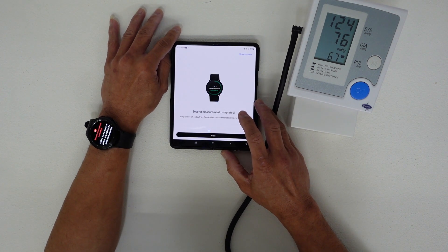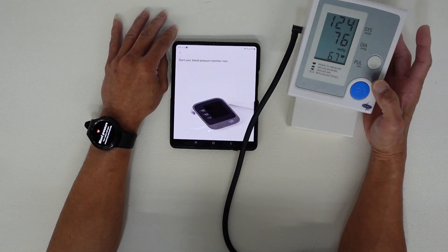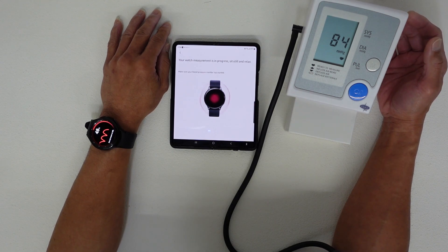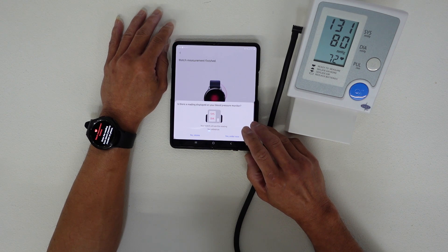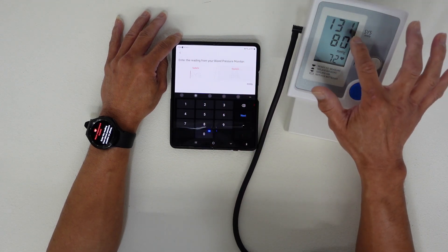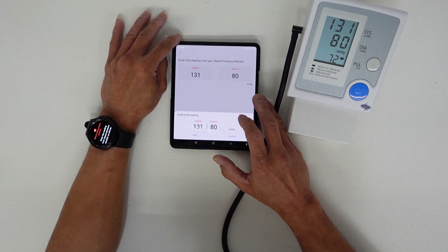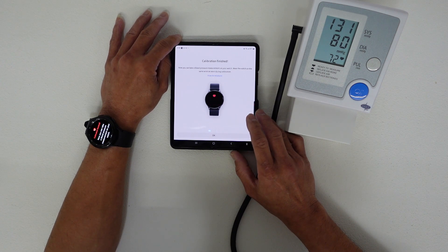For the third and final measurement, we press Next and do it again. The third reading is 131 over 80 — systolic is 131 and diastolic is 80. We press Done and confirm. Calibration is now finished! The app says you can now take blood pressure measurements on your watch, wearing it on the same wrist as during calibration. We press OK.